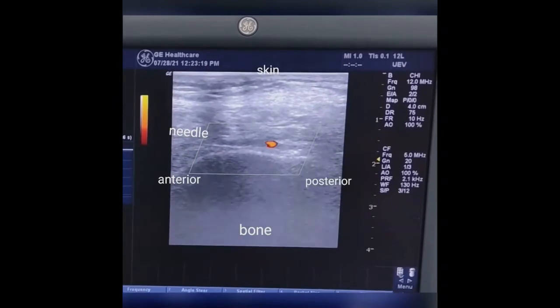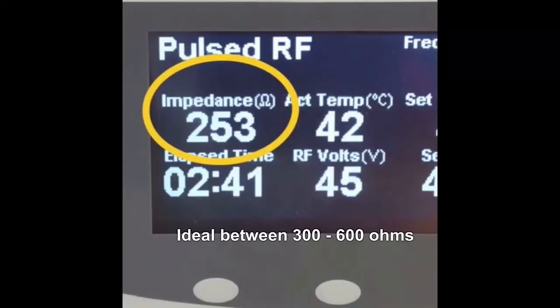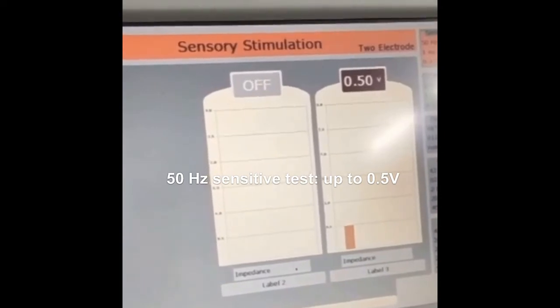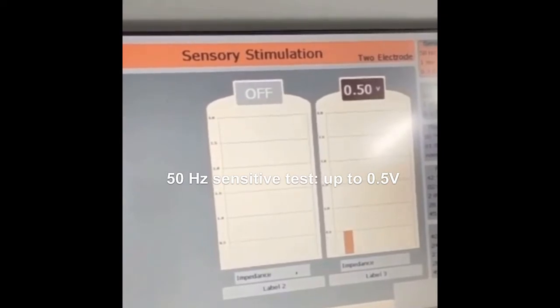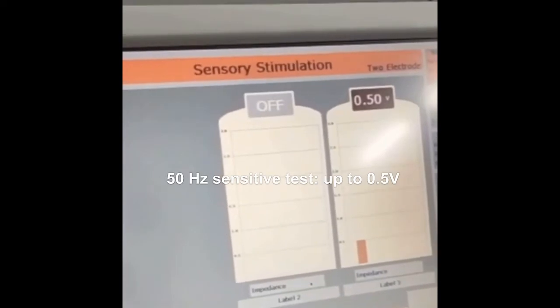Not infrequently we are unable to visualize the nerve, so the fine adjustment of proximity to the nerve is obtained by analyzing the local tissue bioimpedance, which must be between 300 and 600 ohms. We apply a sensitive stimulus at a frequency of 50 Hz and a voltage of up to 0.5 V, and once correctly positioned, the patient will report pain consistent with their complaints.